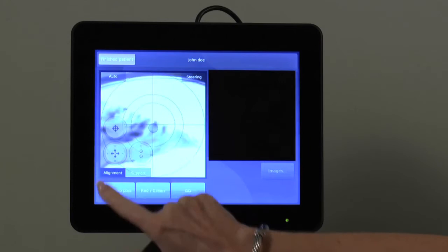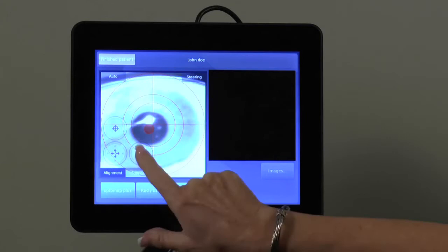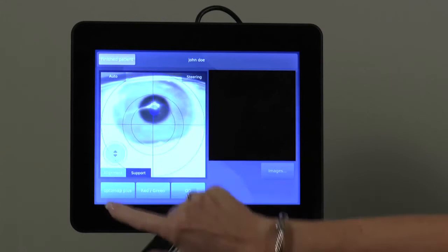You may also adjust alignment using the touchscreen to move the device in either the x- or y-axis using this button, or the z-axis with this button. Tapping the top button will move the device back to its neutral starting point. The chin rest can also be adjusted by selecting the support button and moving it up or down as necessary.